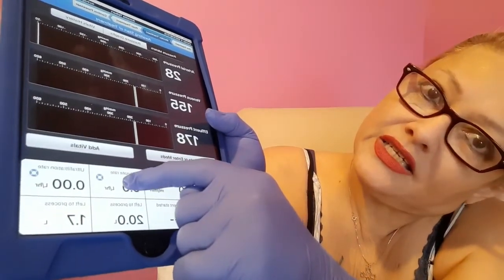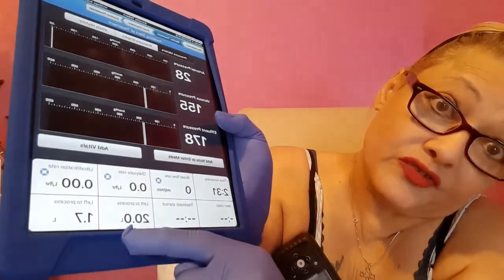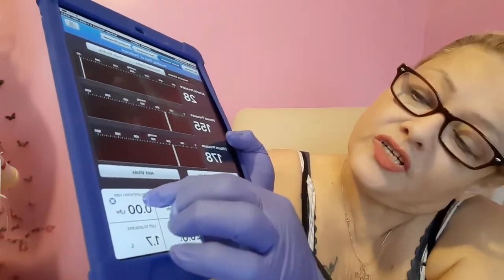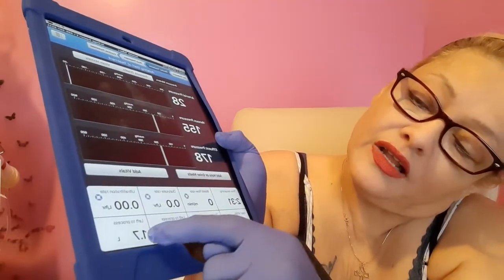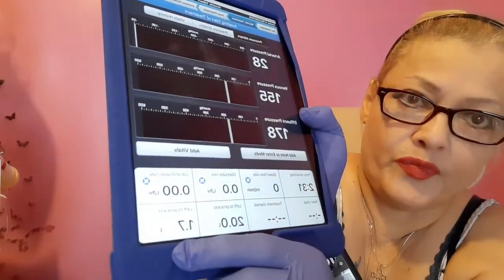Then it'll have the dialysis rate, left to process, which is the whole 20 liters right now because I haven't started. It has the ultrafiltration rate, and once I start, it'll read, and then what's left to process. This is the total amount that I need to take off, 1.7 liters. All right, so I keep track of that. I can just look at this iPad, and it'll tell me where I'm at in the process of my treatment. All right, so without further ado, here comes the fun.